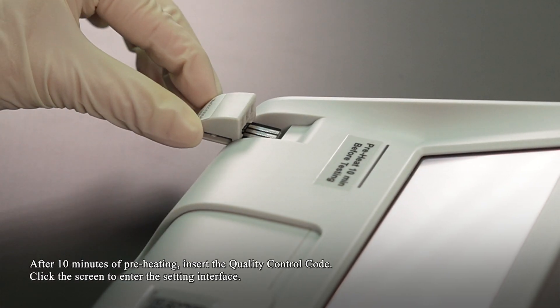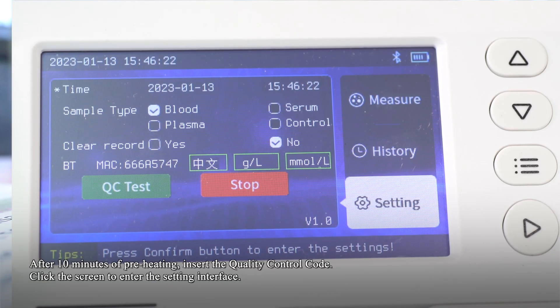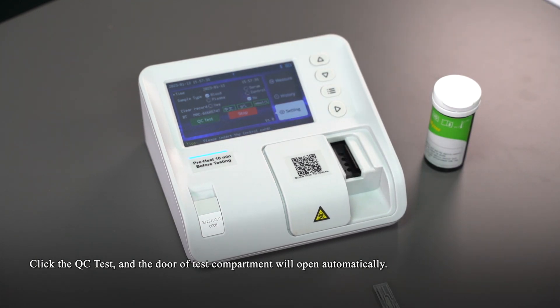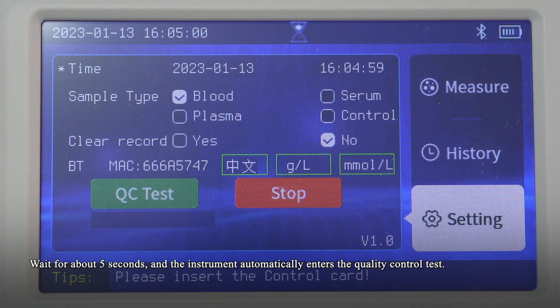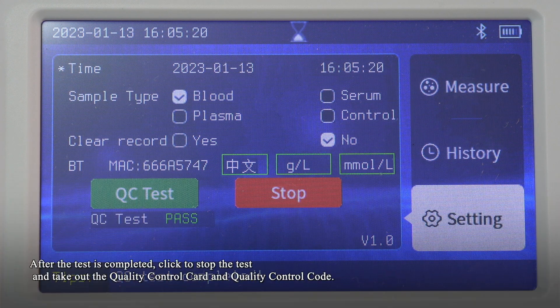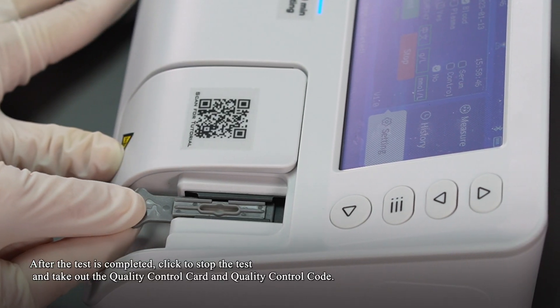After 10 minutes of preheating, insert the quality control code. Click the screen to enter the setting interface. Click QC Test and the test compartment door will open automatically. Insert the corresponding quality control card as prompted. Wait about 5 seconds and the instrument automatically enters the quality control test. Wait for the quality control result. If it passes, it means the instrument is available; otherwise, contact us to solve the problem. After the test is completed, click to stop the test and take out the quality control card and quality control code.